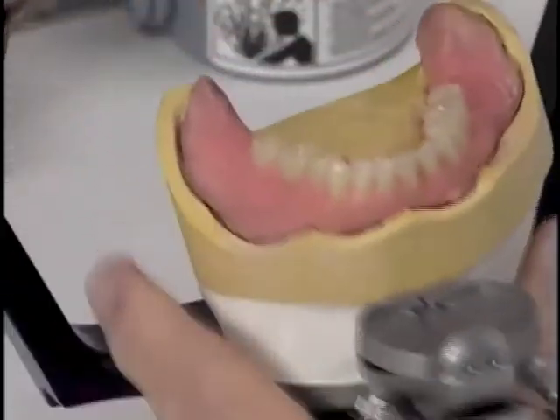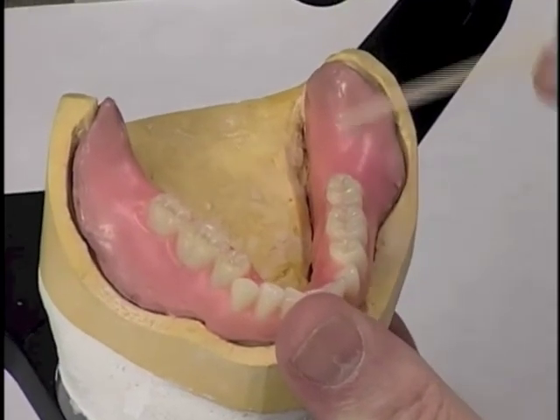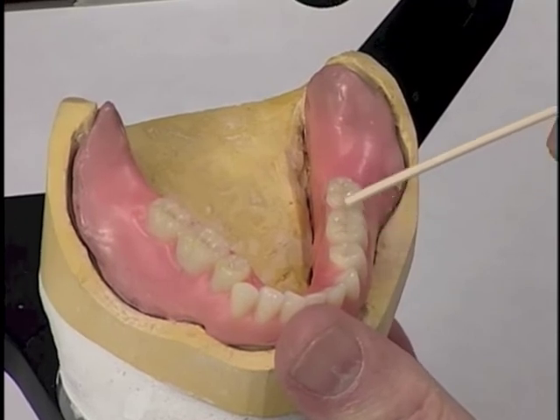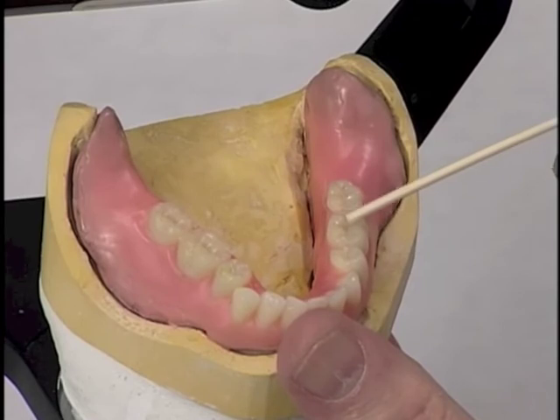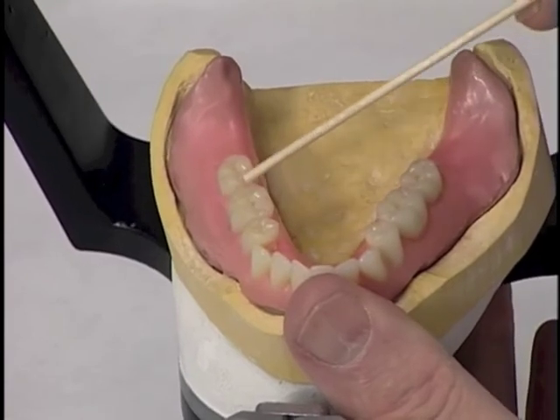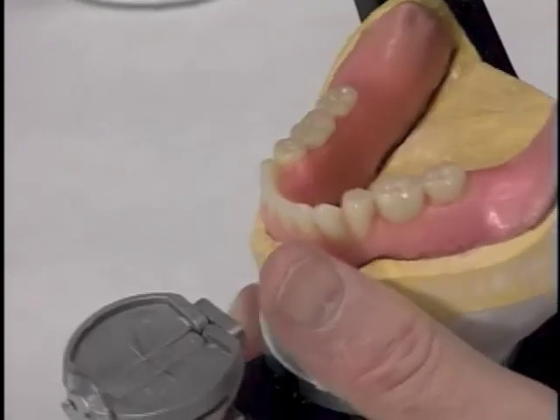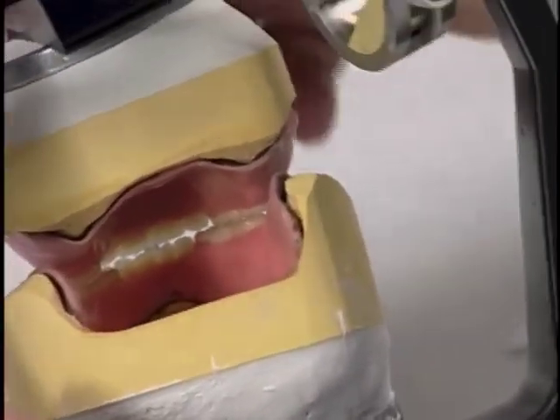We also need to pay attention to the fact that the teeth are over the ridge, in that if we project where the residual ridge is on this particular patient, the central grooves of all of these posterior teeth are over the ridge. That's true both for right and left side. We also would like to take a look at the linguals of these teeth.